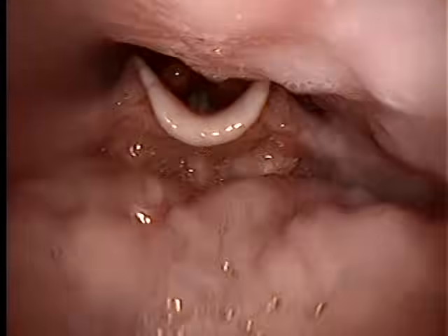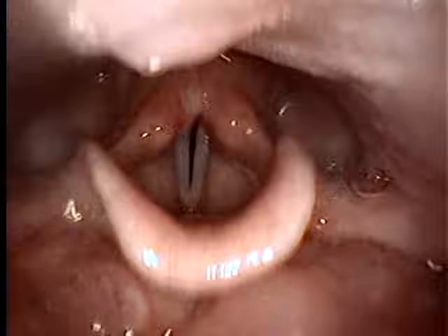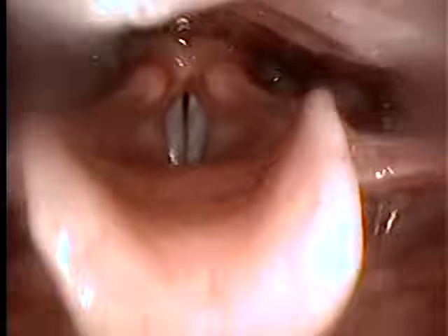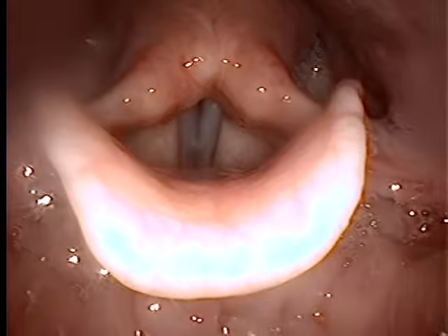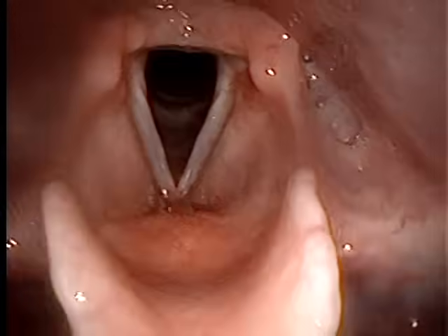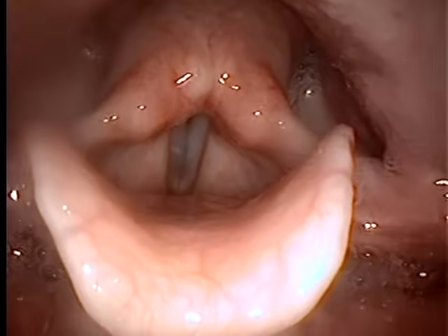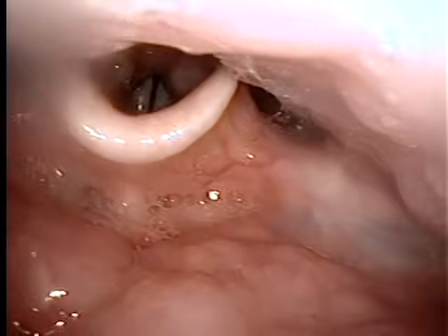It didn't sound great, but it's hard to do when I'm in this position. Let me try. Now I'm going to do A. This is mixed. A. And then this is belt. A. You can't see a huge difference at this point. No, especially not with certain vowels you can't.